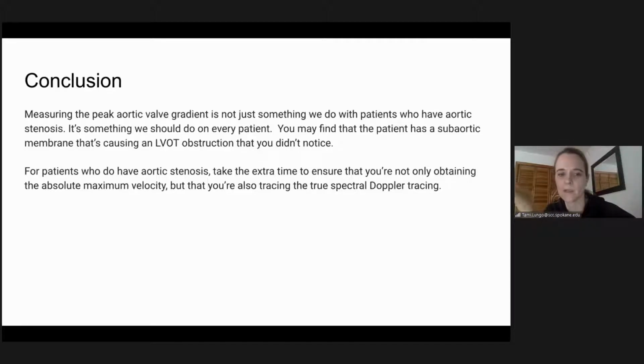I guess I'm thinking you guys haven't seen membranes in the LV outflow tract. So before that valve, which would be considered subaortic, it's called a subaortic membrane because it's before the valve, and anything after the valve is supra. So you'll get a little thing that looks like it's hanging down from the interventricular septum, and it will cause subaortic stenosis. You may not see it in the parasternal long, but in the apical 5 chamber, if you Doppler and you pick up some type of step up in gradient, then you have to be concerned where that's at.